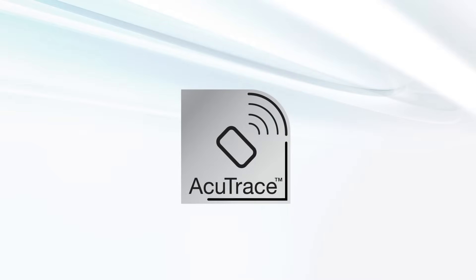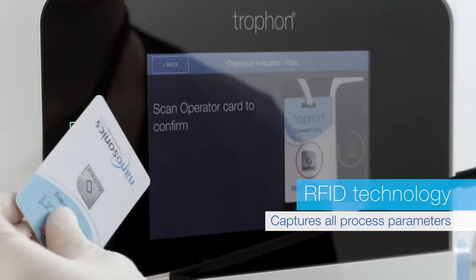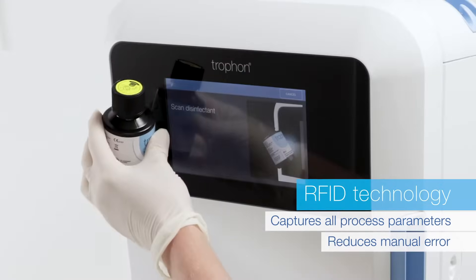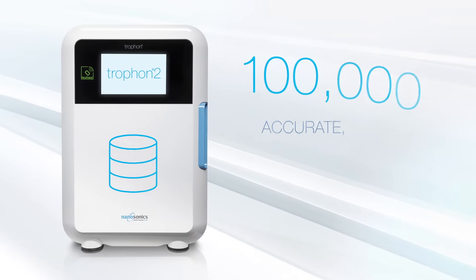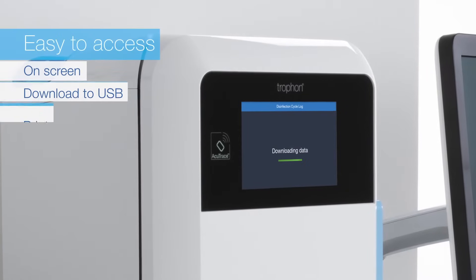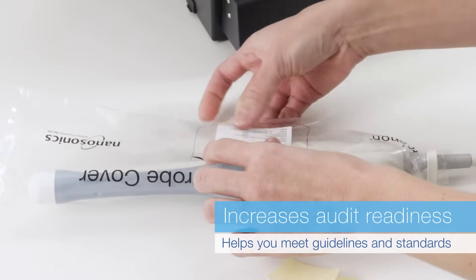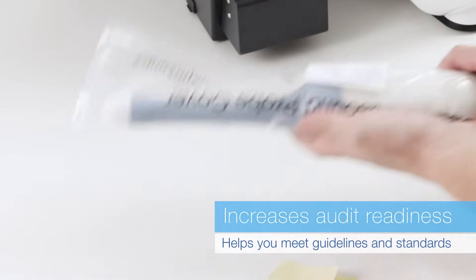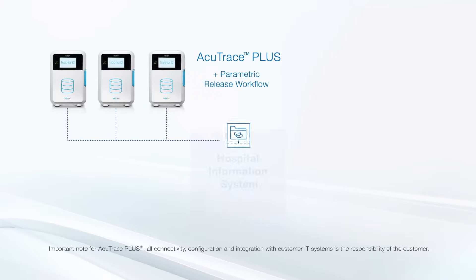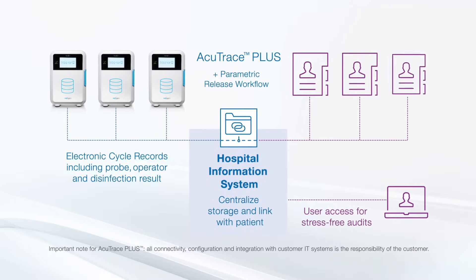Trofon2 features AccuTrace digital traceability with RFID technology to capture all process parameters, reducing manual error. Trofon2 stores up to 100,000 accurate digital disinfection records with easy access, increasing audit readiness and helping you meet guidelines and standards. Add optional AccuTrace Plus to connect your hospital IT system to centralize data and link stored disinfection records to each patient.